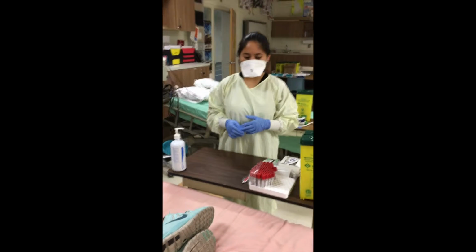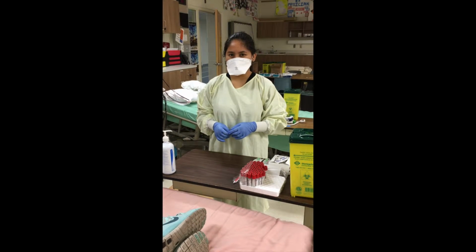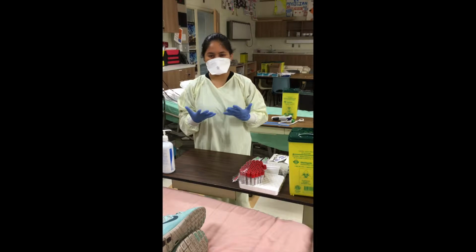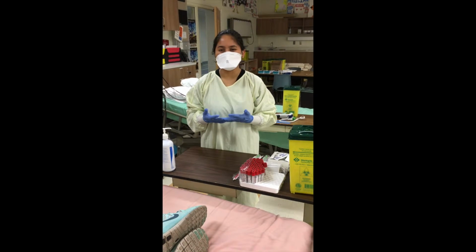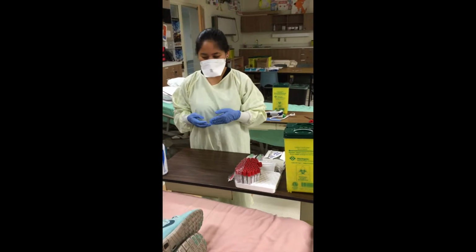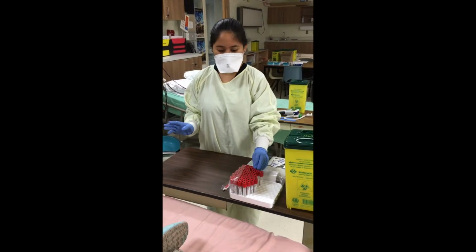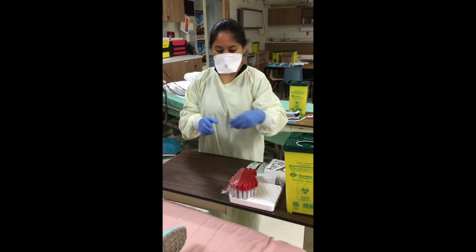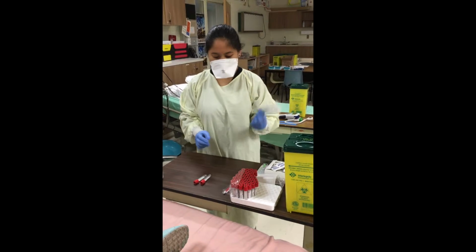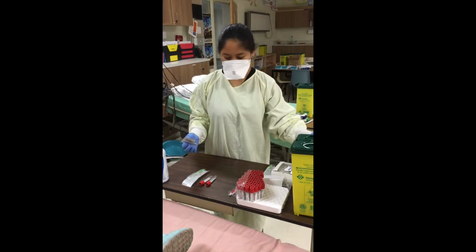Taking blood from an airborne isolation room. So what we need as our personal equipment is an N95 mask, gloves, and a gown. And for taking blood, we have hand sanitizer to clean our hands, and then we have the vials. It depends on how many you need. We also need a Vacutainer, alcohol swabs, and gauze.